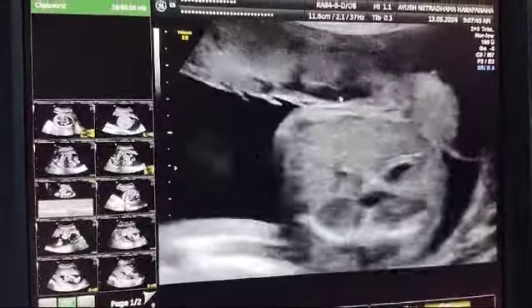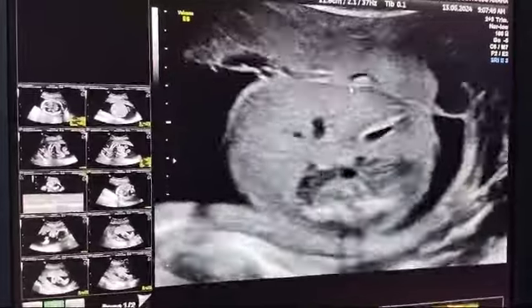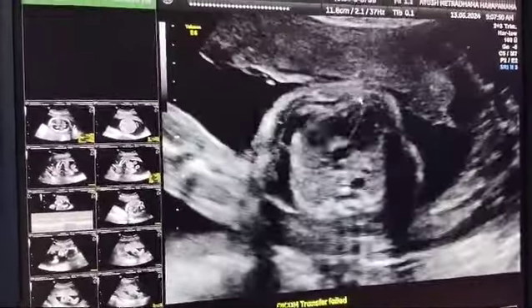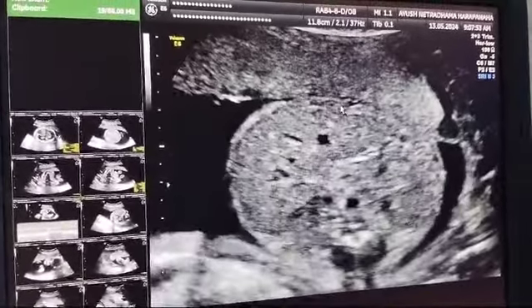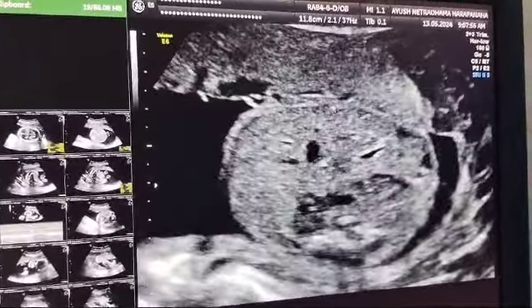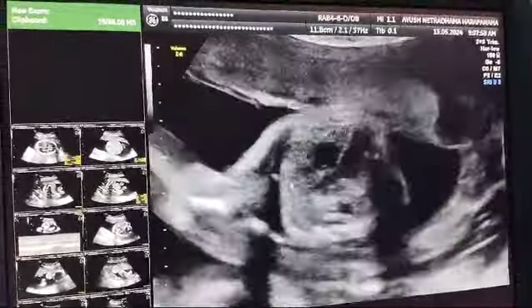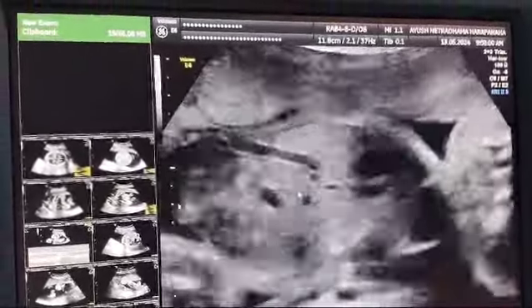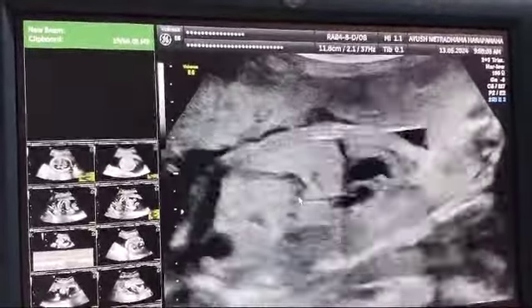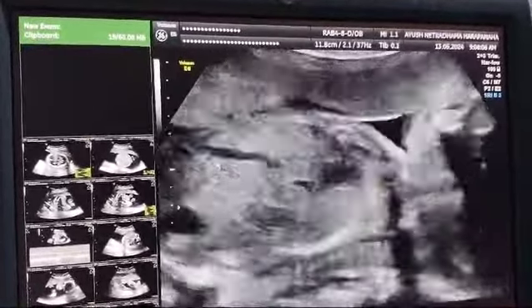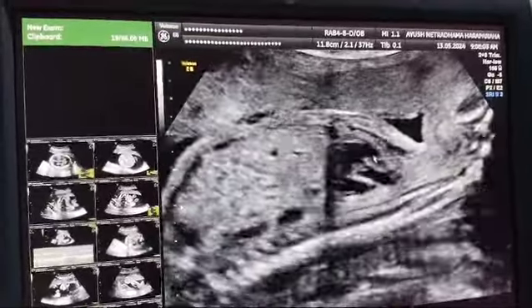When we go to the abdomen, this is the thorax and the abdomen — there is a protruded abdomen-like appearance. The diameter of the abdomen is more as compared to the thorax. There is a disproportionate appearance, and on this sagittal profile you can see that the abdomen is slightly protruding as compared to the narrow thorax.